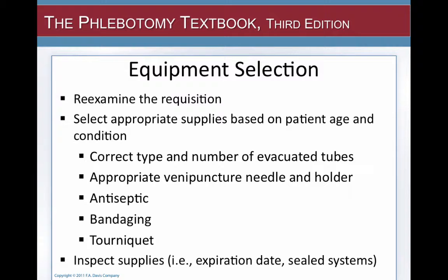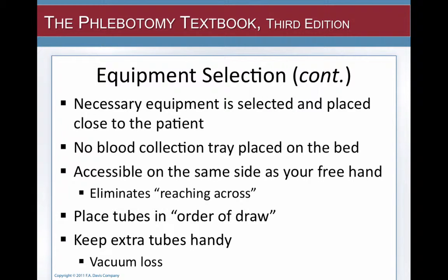Before you've actually gone up on the floor, you've probably already inspected your supplies on your phlebotomy tray, meaning you've looked at the expiration dates, etc., and make sure that everything is as it should be. It's necessary that the equipment is selected and placed close to the patient.